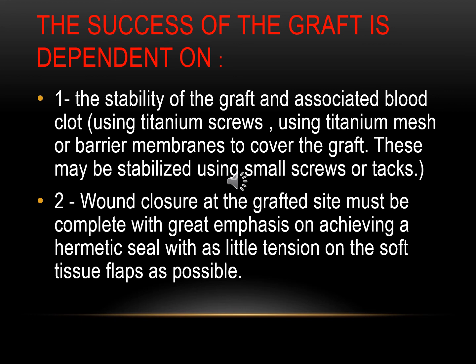After that, we can fix the membrane by using small screws or tacks. Second factor for success of the graft is good closure of the wound at the grafted site. It must be complete with great emphasis on achieving a hermetic seal with as little tension or no tension of the soft tissue flap as possible.